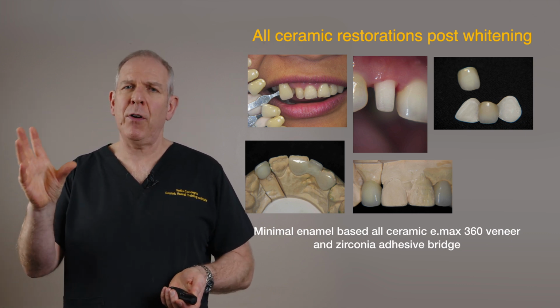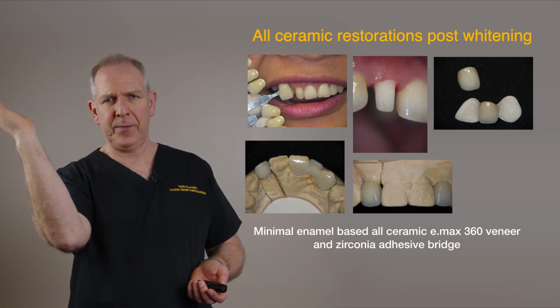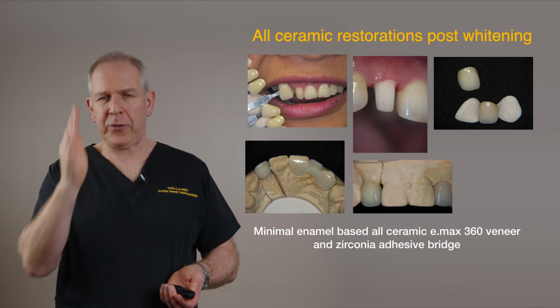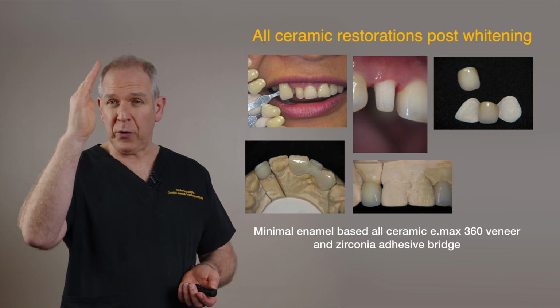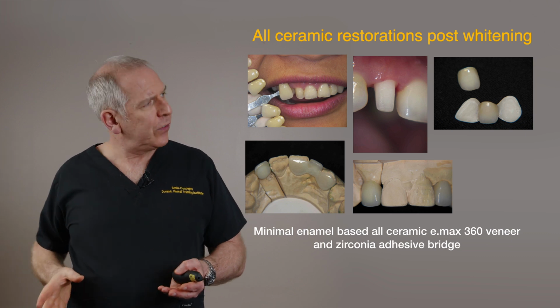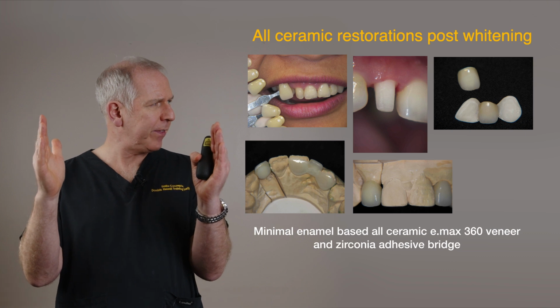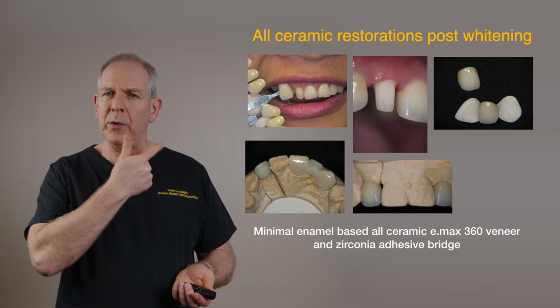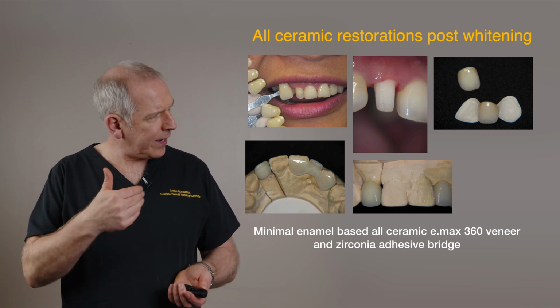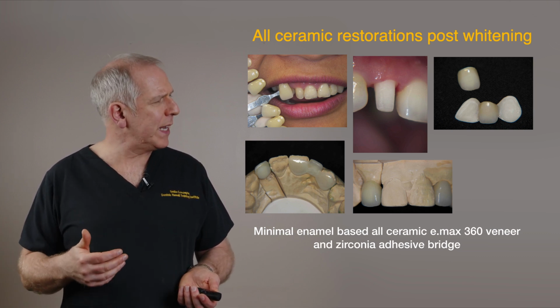If we cantilever off the canine, there's always a risk that that canine is going to move. Likewise, if we distal abut off the lateral, off the central, that lateral may move. And I've seen that happen a lot post-ortho. So generally, yeah, one wing would be preferable, but that is going to splint our teeth. Then we're going to put bonded wire on the 1, 2, 3 on the right, extending that round further back if we need to.